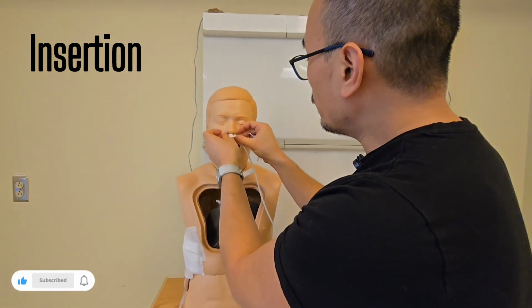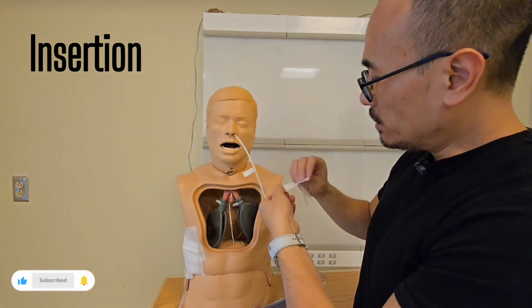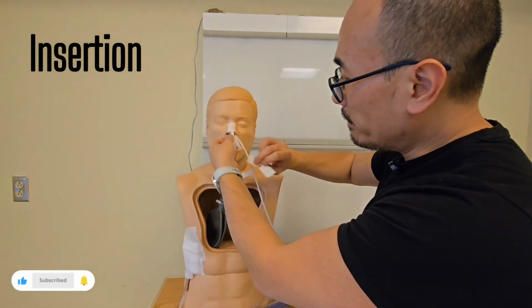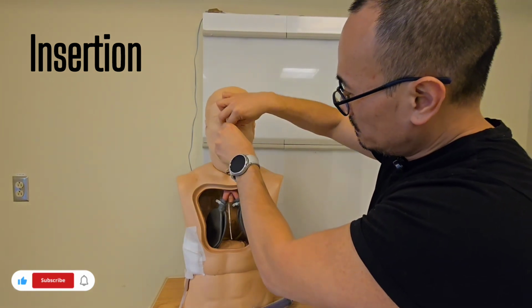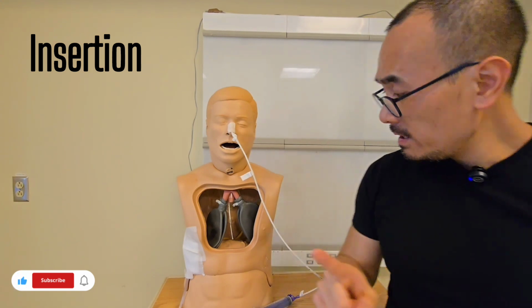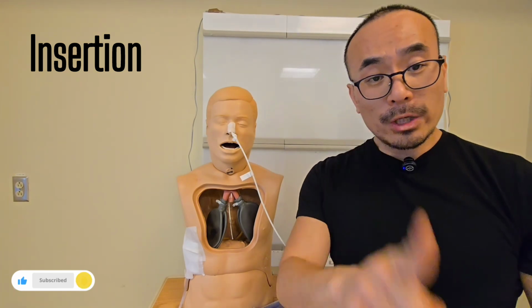We are going to secure our tube for our patient. And at this point, we are going to need an X-ray. So we are going to remove this part, and we're just going to affix the tube just temporarily. Okay, this one is a temporary measure. At this point, the patient's going to need an X-ray to confirm that the tube is actually in the esophagus. Once the X-ray is done, we'll continue from here.